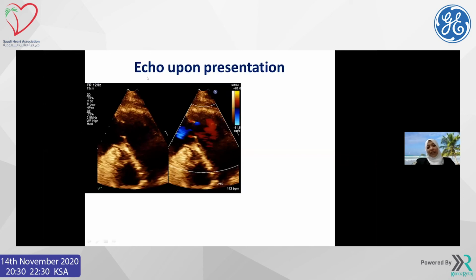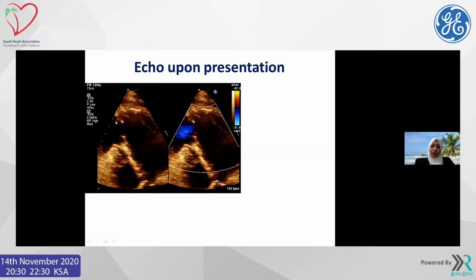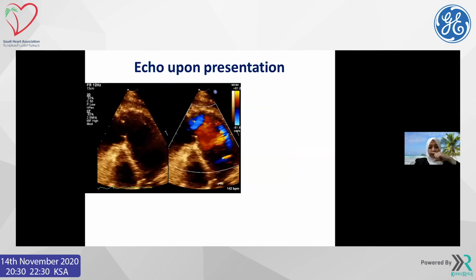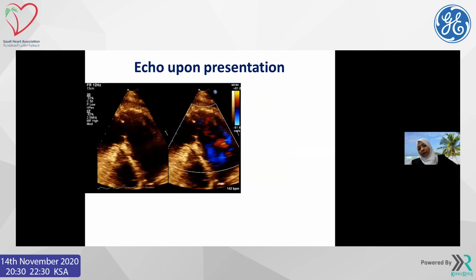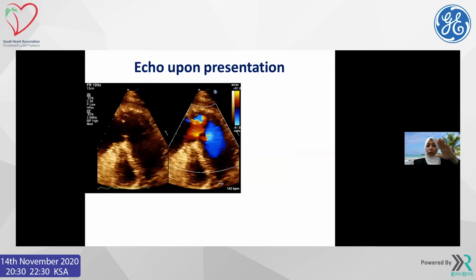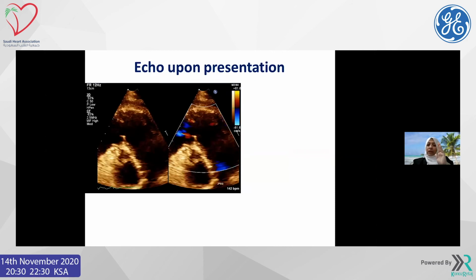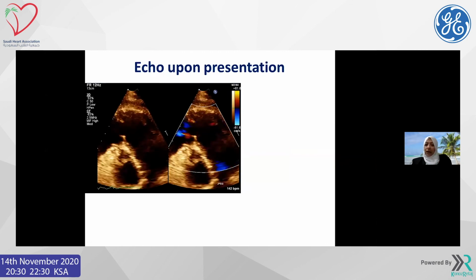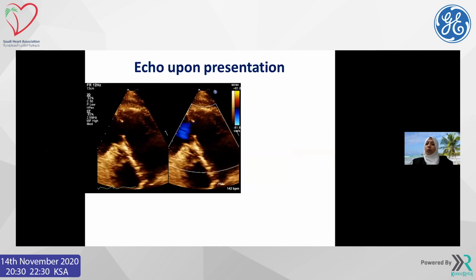This patient, the question before, of course, was if we have it as a VSD, so you will see some flow going into the RV, and we cannot see anything. But from the start, if you remember, we showed you that the apex of the interventricular septum, the apical segment, is going too low from the large area of the apical dyskinesia, which was initially covered by the thrombus. And this was nicely seen.